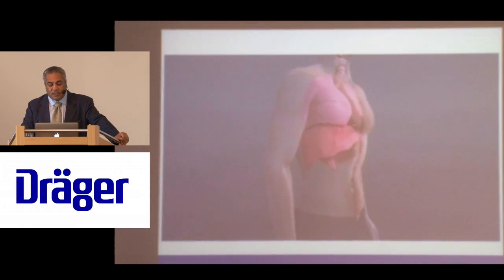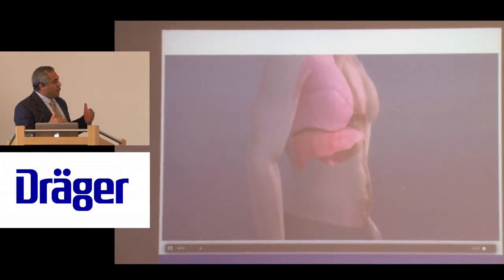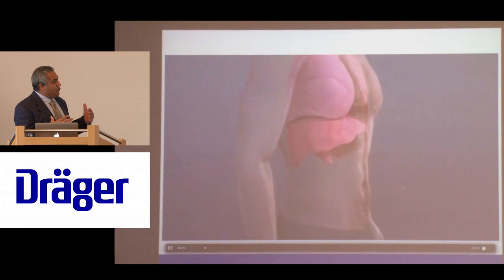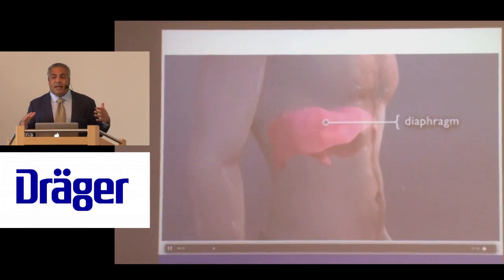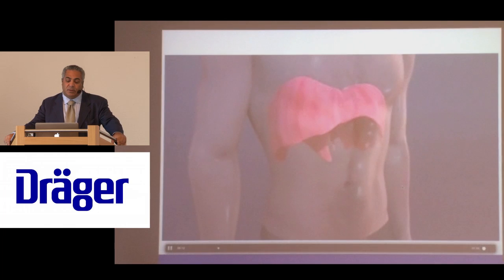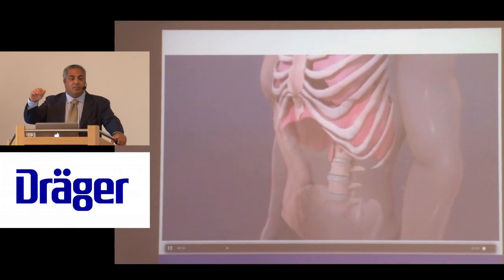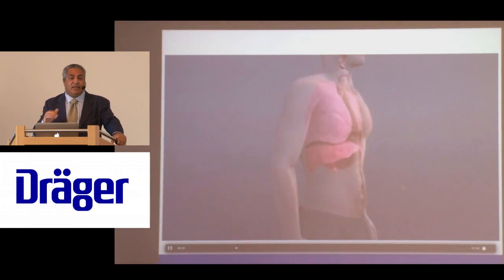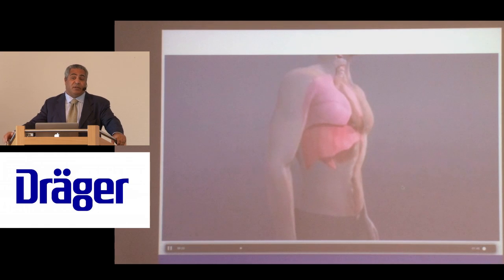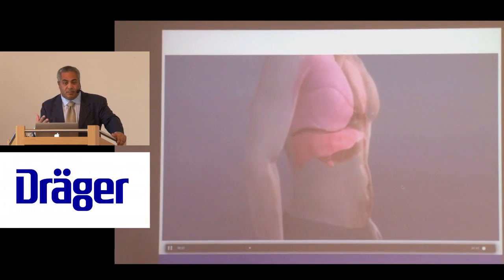And if you watch this little video here, you'll see as your lung volume gets bigger, CPAP level goes up. At some point you have to squeeze the air back out, and then if you relax your stomach, your lung will passively fill. And this is called defending your lung volume. And you can titrate the CPAP level and see people switch from active inspiration to active exhalation. Of course, if you keep going, they'll look like they want to have a baby or bear down. Of course, that's a little bit too much expiratory work.